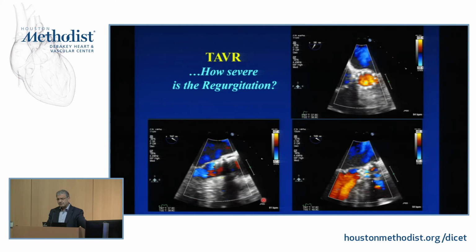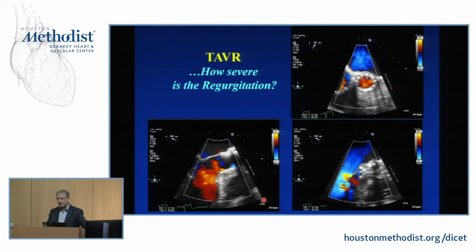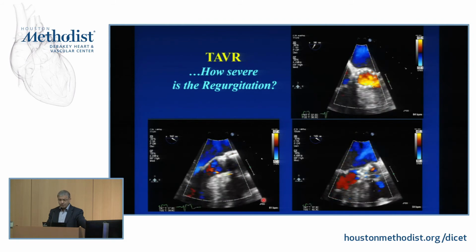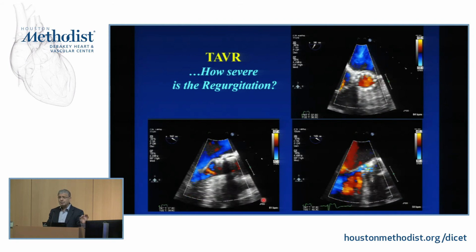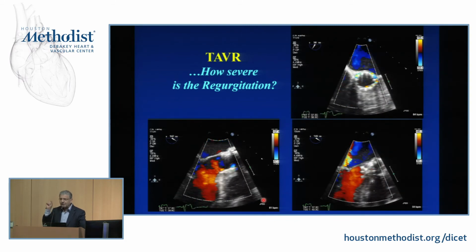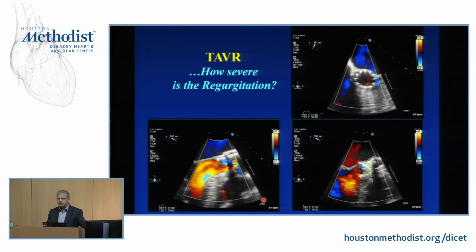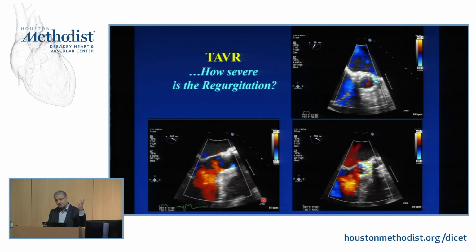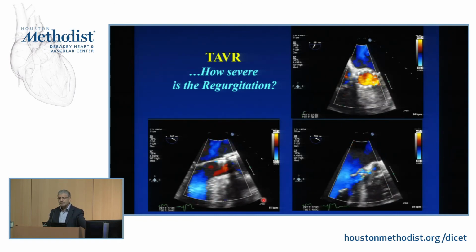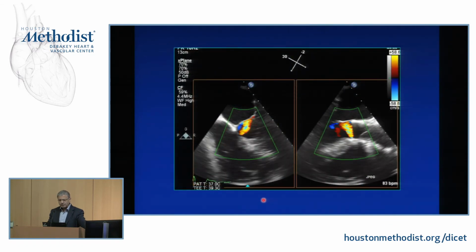Unfortunately, I've been tasked to take a look at these, and the data is soft, and we're going to have to come up with a consensus of what to do with TAVR, because as opposed to SAVR, you're going to have punctate areas. You have different areas because of where calcifications are or non-full expansion, as opposed to SAVR, where you have maybe a suture that has gotten loose or something like this. Much easier after surgery as opposed to after a TAVR procedure.